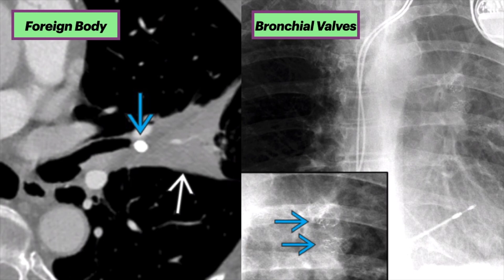Let's move on to endobronchial obstruction. On the left is a foreign body in this elderly individual who aspirated a dental filling. He presented with new left upper lobe opacity, showing this metallic foreign body in the lumen of the superior lingular segmental bronchus and surrounding atelectasis. The right-hand chest x-ray shows a person who underwent volume reduction therapy with bronchial valves, seen on the inset at the bottom, with resultant left upper lobe atelectasis. The bronchial valves act as an obstructing foreign body to achieve volume reduction.